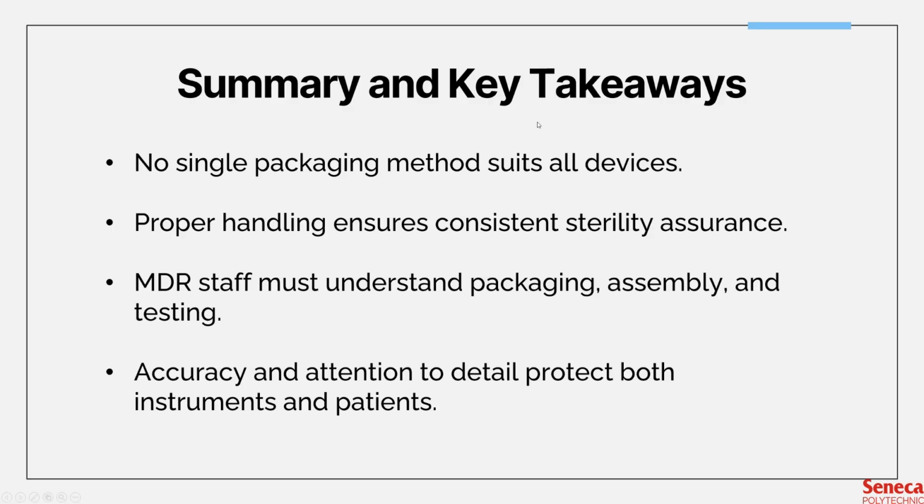So now let's look at summary and key takeaways. Let's summarize what we've learned in week 7 thus far. There's no single packaging method that suits all medical devices. Selection depends on the device design and sterilization methods. Proper handling, cleaning, and assembly of containers are key to maintaining sterility assurance.